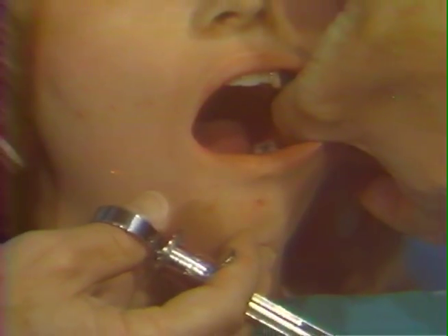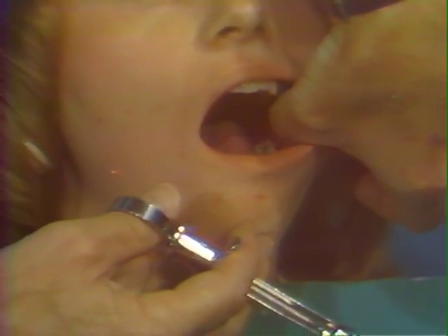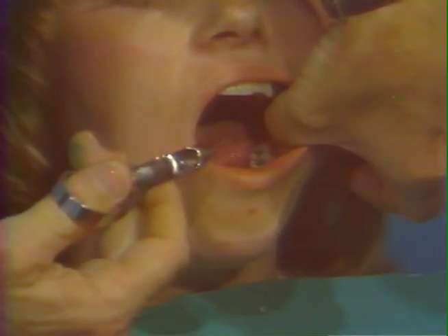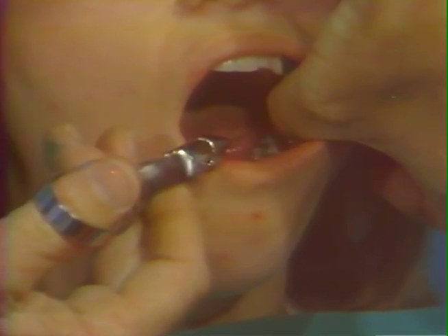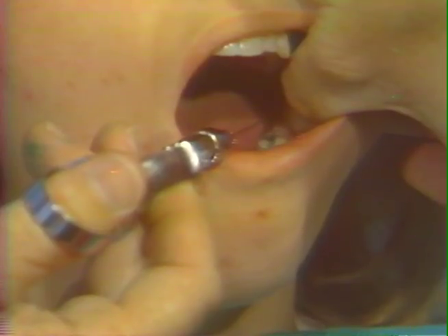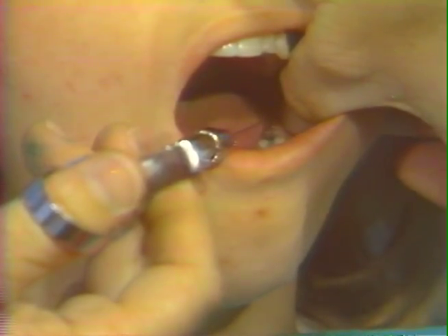The thumb can be utilized as the palpating finger to feel the coronoid notch, palpating the internal oblique ridge. The approach is opposite the bicuspid teeth of the opposite side, the first reference point being the internal oblique ridge. If this is encountered, displace the needle medially with the thumb and continue backward in a straight direct thrust movement. The needle is then removed in the same plane.